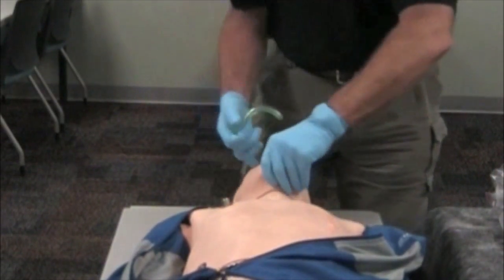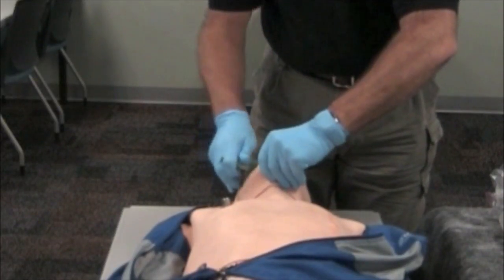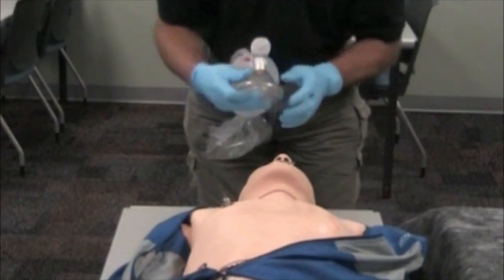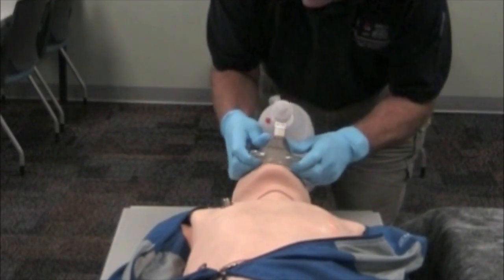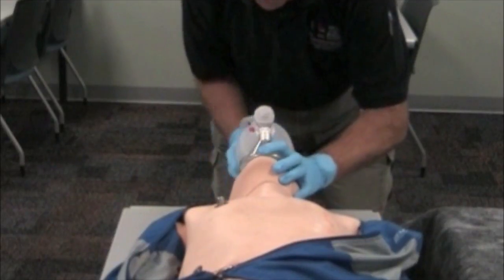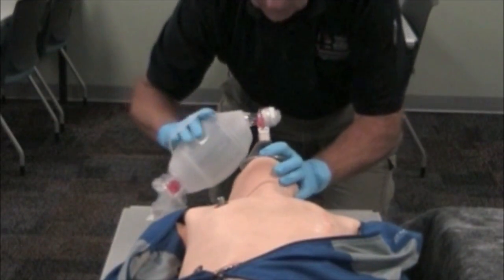I would insert an oropharyngeal airway. No gag reflex is present and the patient accepts the airway adjunct. I'll place my mask, get a good airway open, get a good seal with the mask, and begin ventilations.